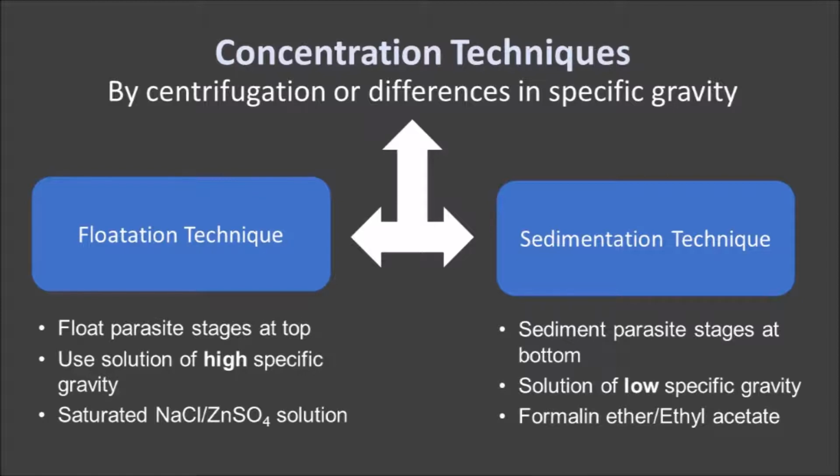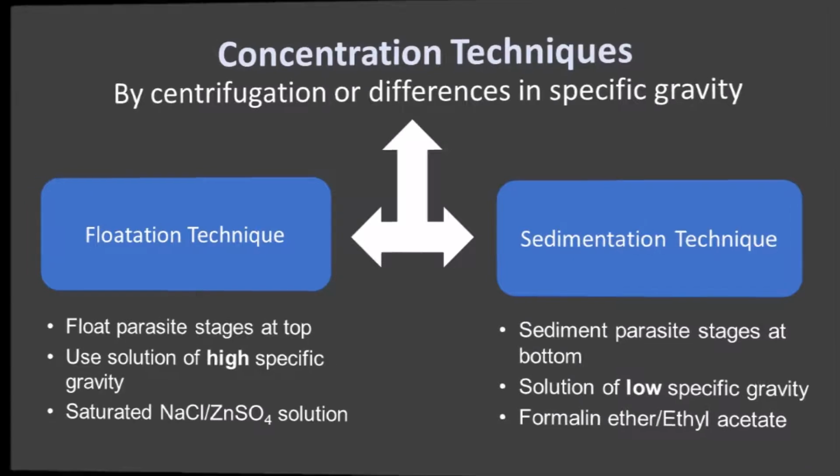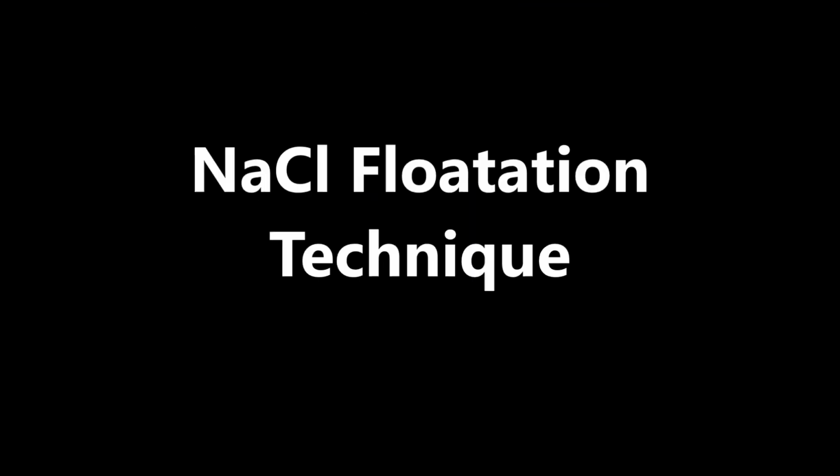Solutions used for the sedimentation procedure are formalin ether or ethyl acetate. We will look at the sodium chloride flotation technique in this presentation.